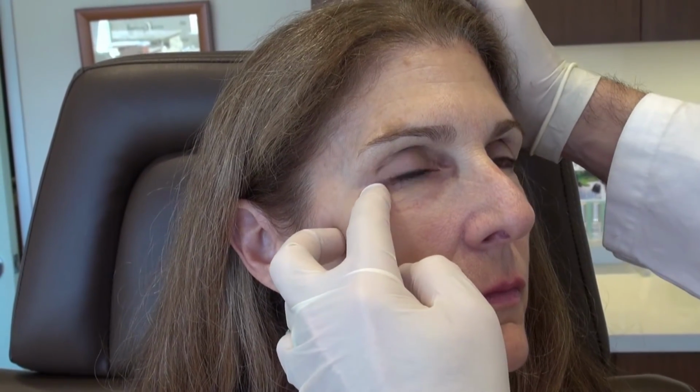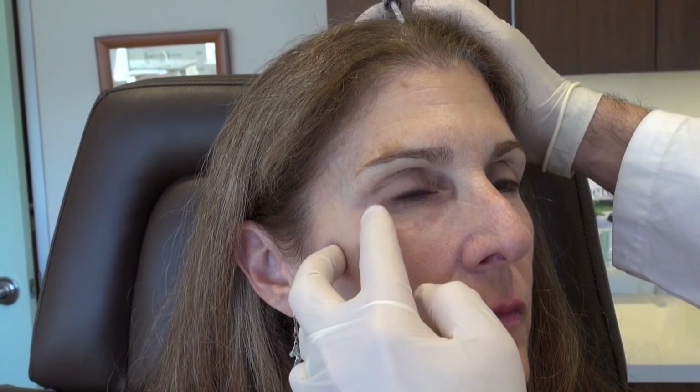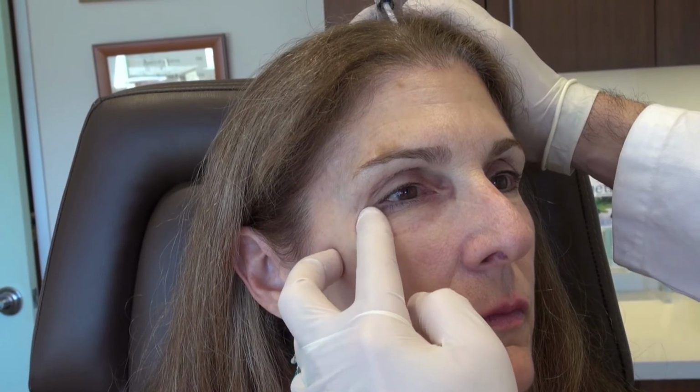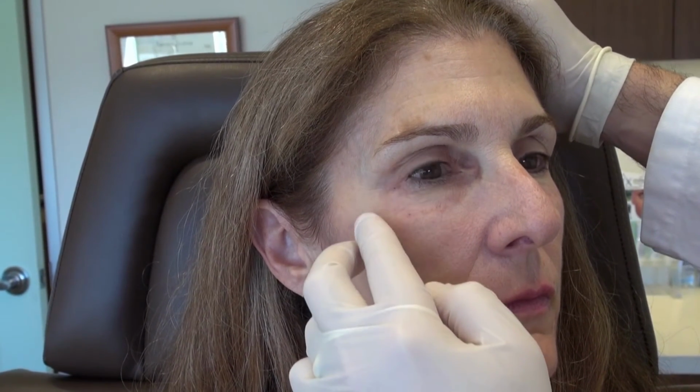The lateral aspect of the tear trough is especially tricky because the septum actually comes a little bit anterior in that area, and so it's actually easier to get behind the septum there than it is in the more medial aspect.